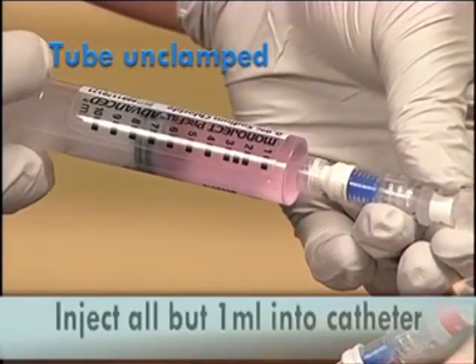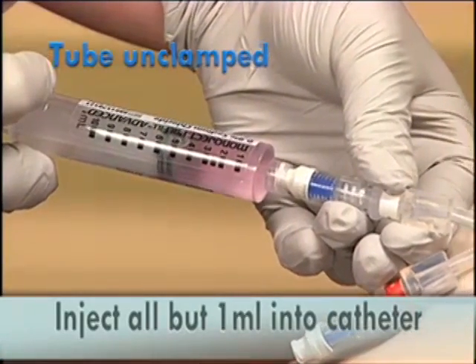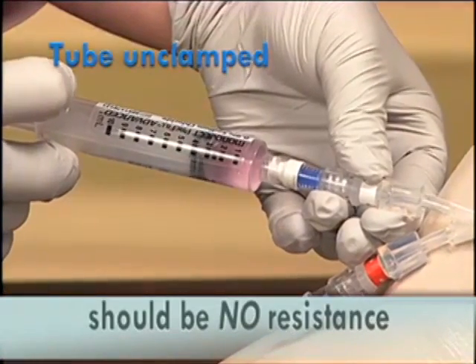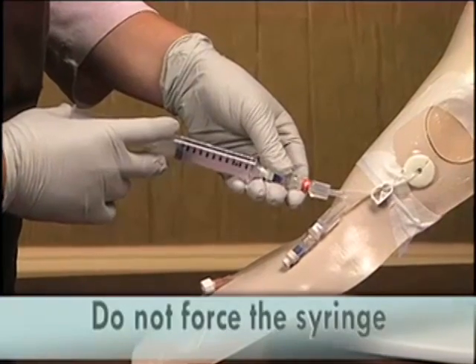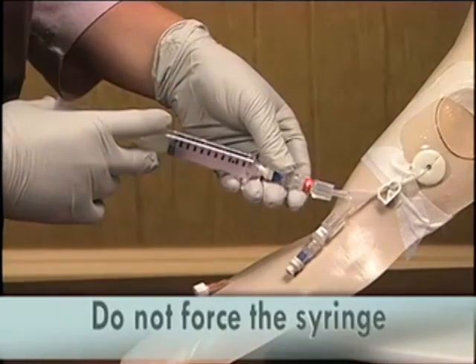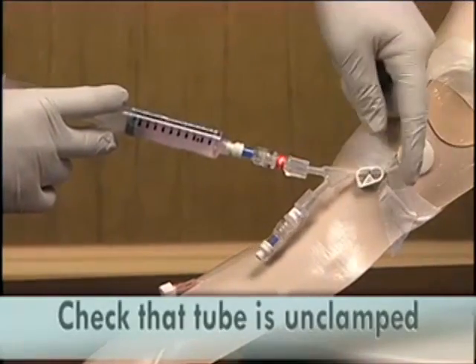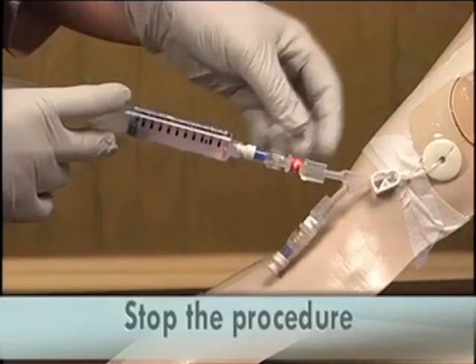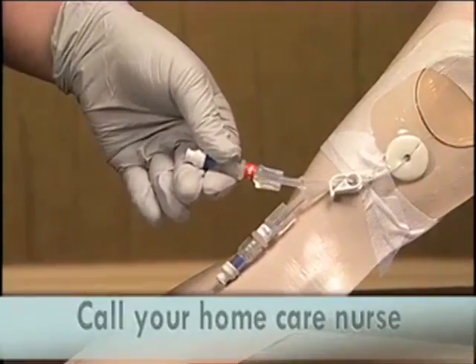Slowly push the plunger of the syringe to inject the solution. There should be no resistance when attempting to instill the solution. If there is resistance, do not force it. Check that the tube is completely unclamped. If it is, discontinue the procedure and call your home care nurse promptly.